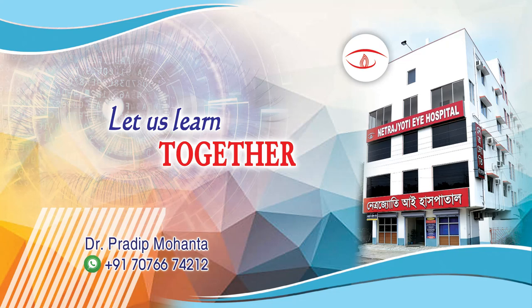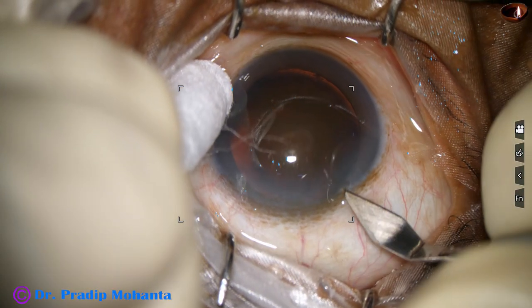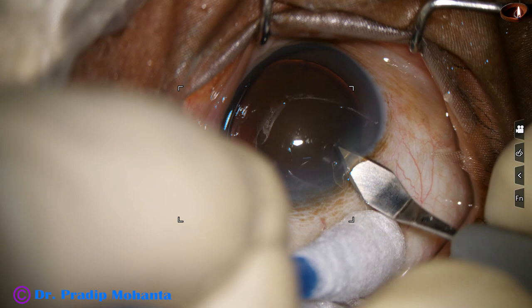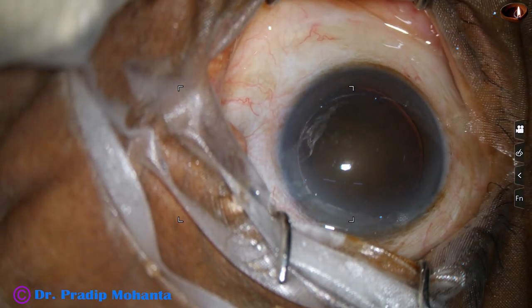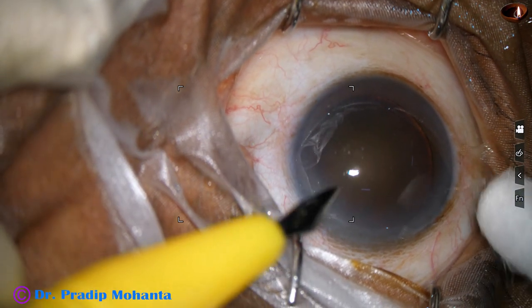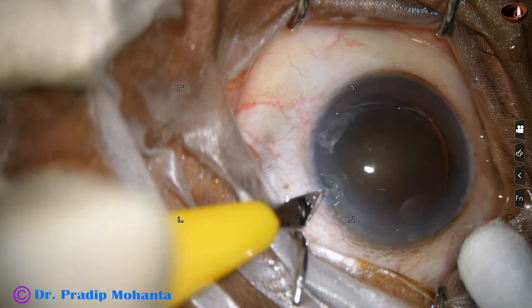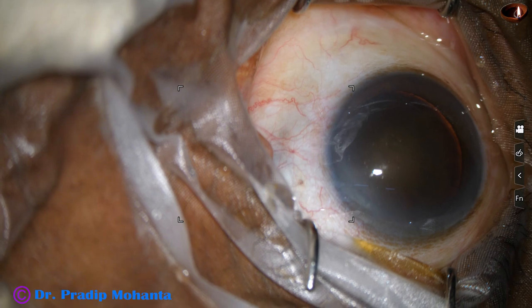Friends, we are going to see a totally unedited recording of phaco of this hard cataract. Here goes the main incision with a 2.8 millimeter steel keratome. And now, this is a side port on the left side of the main incision. The eye is deep-seated.